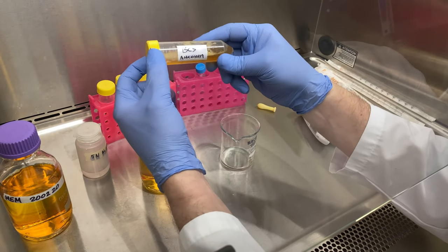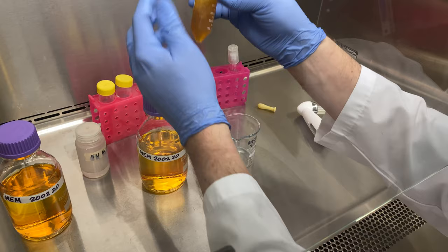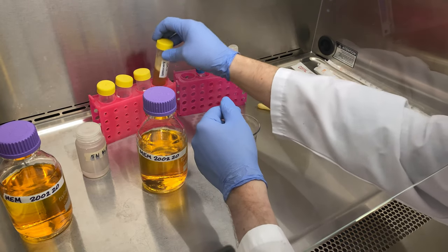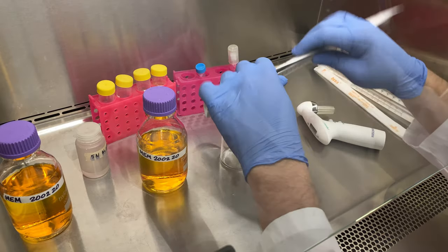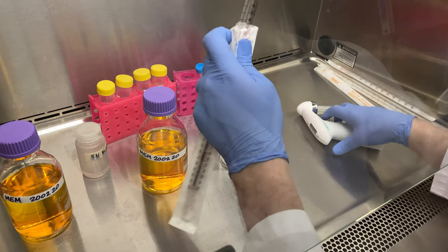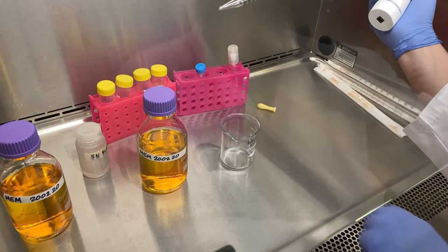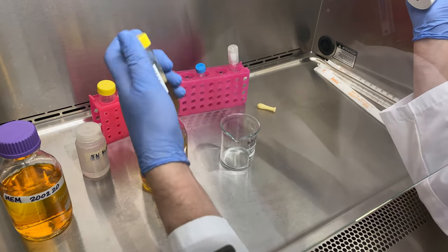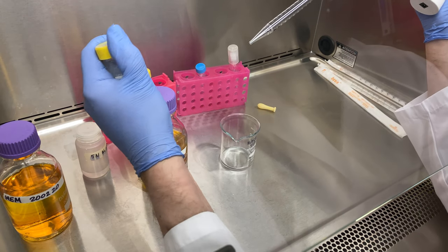Next up, we're going to add in bovine calf serum. Bovine calf serum is added because it's full of growth factors. You could purchase purified growth factors, but it's much cheaper just to use bovine calf serum. We're going to add 50 mils to each for a final volume of 500 mils, meaning this will be a 10% solution of bovine calf serum.